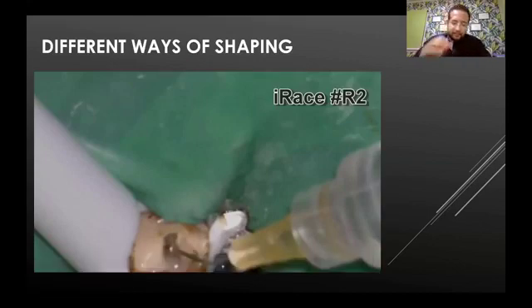As you can see, even with the classic method, like the classic method of Dr. Wael, what recapitulation does is suspend accumulating debris in the irrigant. What happens is when you irrigate, you fill the canal with irrigant, but the debris still accumulates at the apical third of the canal. When you do recapitulation, it moves the debris suspended in the irrigant. So when you re-irrigate again, the suspended debris will wash out with the irrigant. So it's also a mechanism for removing debris.